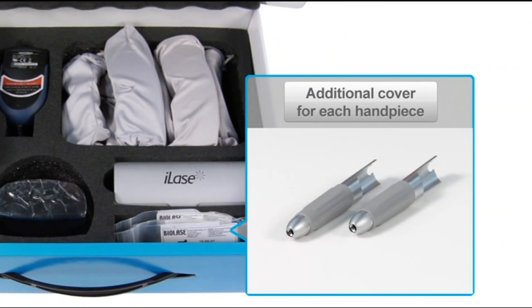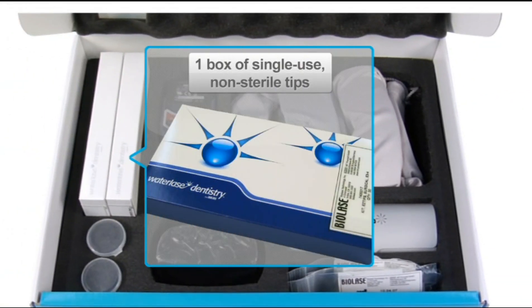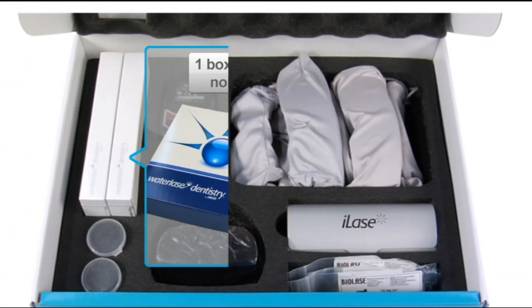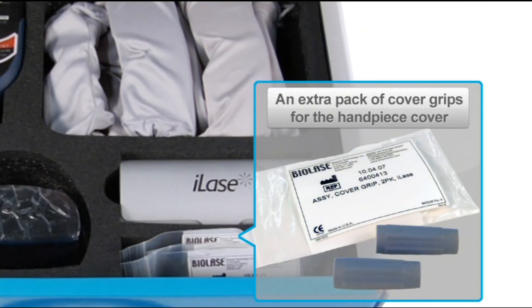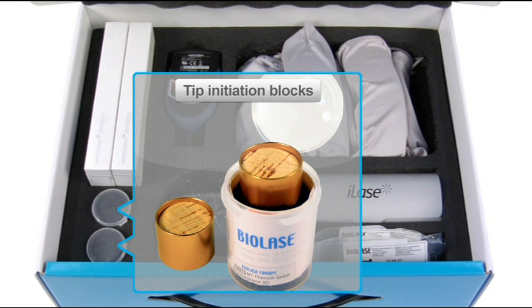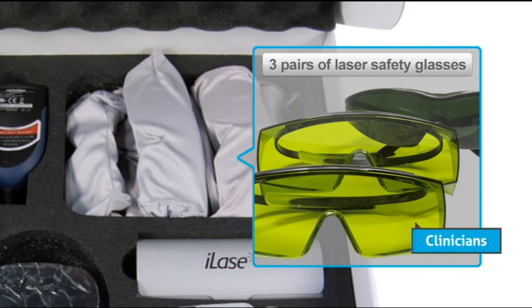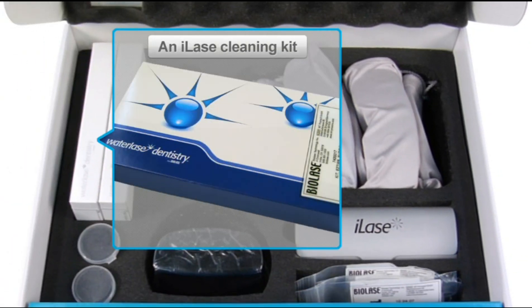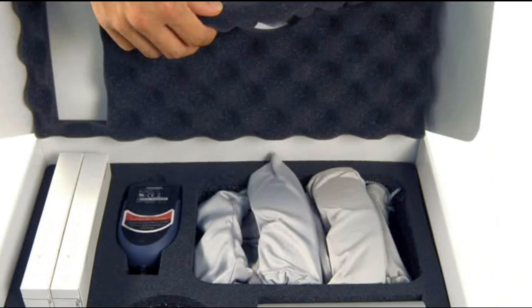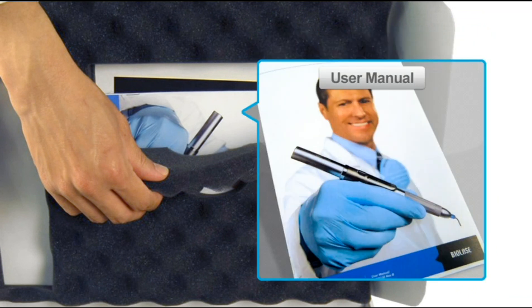Also included is an additional cover for each handpiece, one box of single-use non-sterile tips, an extra pack of cover grips for the handpiece cover, tip initiation blocks, three pairs of laser safety glasses for each handpiece — two pairs for clinicians and one darker pair for the patient — an iLaze cleaning kit, a laser safety sign, and a user manual.